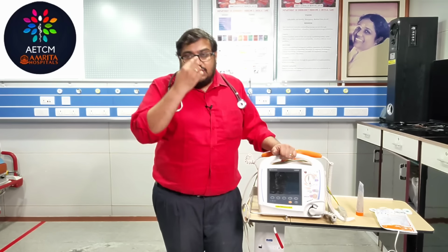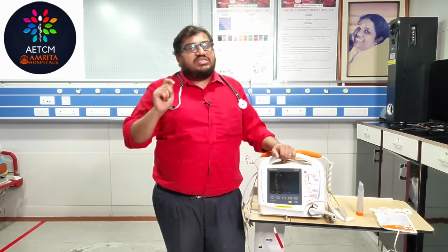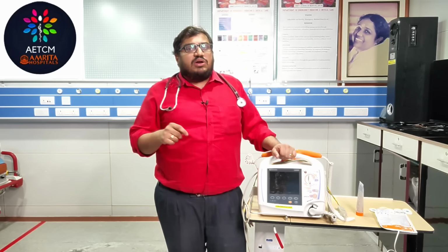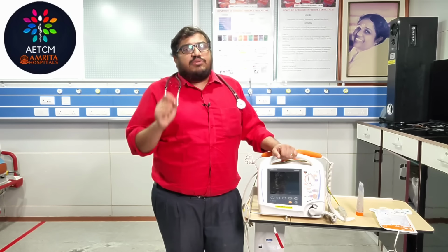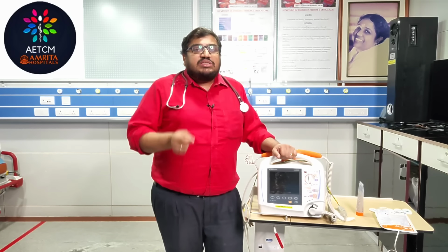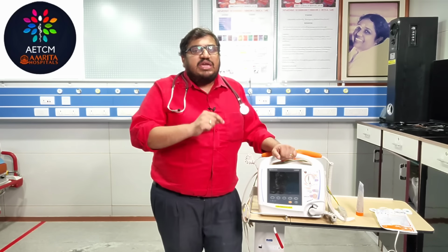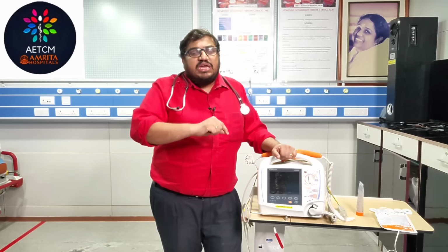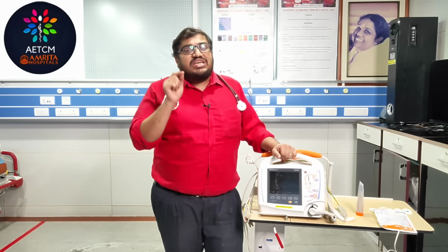And in cardioversion, there is another thing that you need to select, something called synchronization. Otherwise we can say cardioversion is always synchronized cardioversion. What do you mean by synchronization? Synchronization means the shock will be delivered by the machine at the peak of the R wave, or the peak of the QRS complex. So that is regarding synchronized cardioversion.